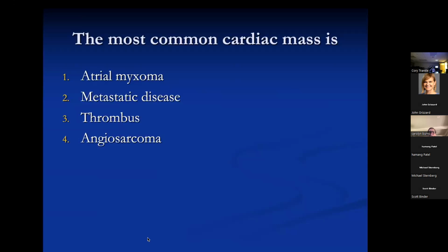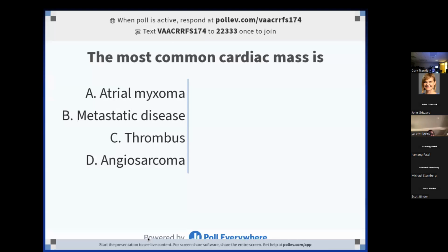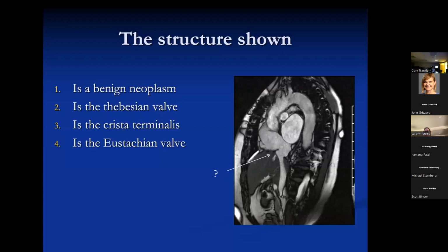Okay, so this is a question that's always asked in radiology board exams, or very frequently: what is the most common cardiac mass, and you see the options there. People can respond if it's working. I guess this will be a test case if anybody has been able to log in. We'll leave that up for just a minute. The text number you can see up at the top. Well, we got a pretty even split between myxoma, METs, and thrombus. Very good. When you get through this, we'll give you the answers to these. They'll become apparent. Sorry to do a head fake there.